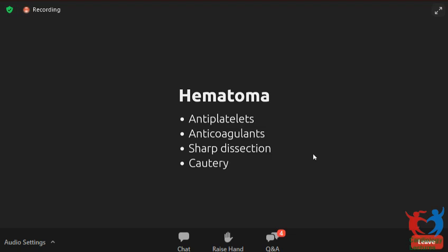This also applies if a patient has an intracardiac shunt which is uncorrected. If a patient has an ASD or a small VSD, even if there's no Eisenmengerization, you can have intermittent right to left shunts. It's safer to keep these patients on systemic anticoagulation unless you're closing the shunt. So in patients with RV leads who have intracardiac shunts, or with a lead in the LV, always anticoagulate.